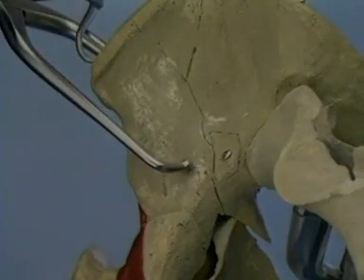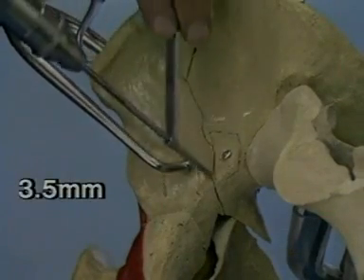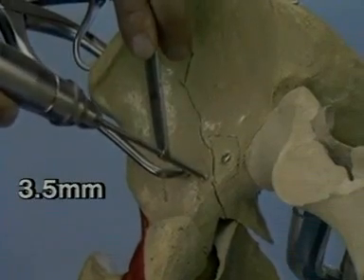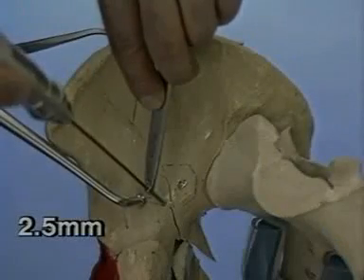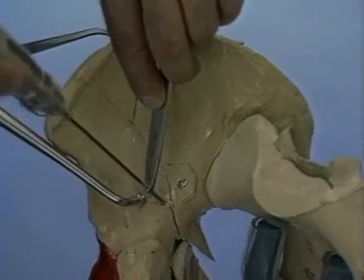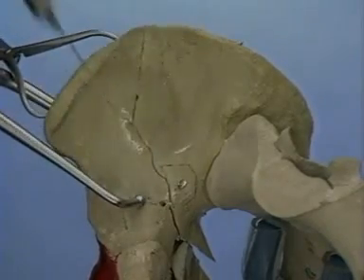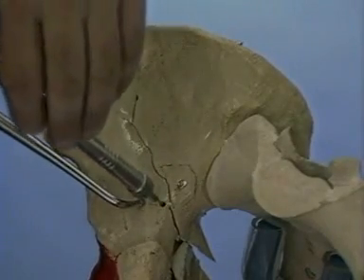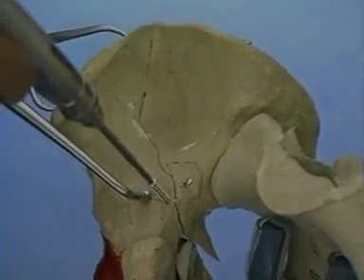Initial fixation of the anterior column is with lag screws. A 3.5 mm drill bit is used near the pelvic brim for the gliding hole. The threaded hole is drilled with a 2.5 mm drill bit. The depth is measured and the 3.5 mm lag screw is inserted.